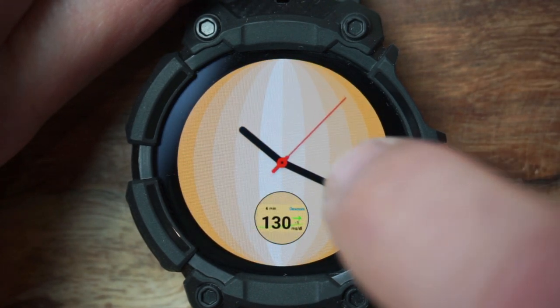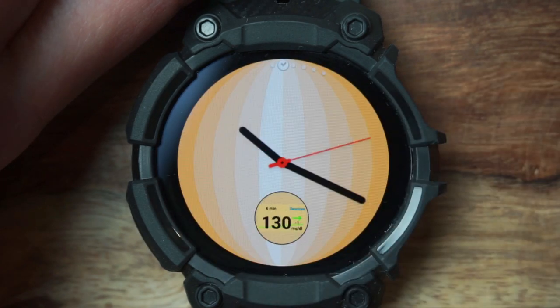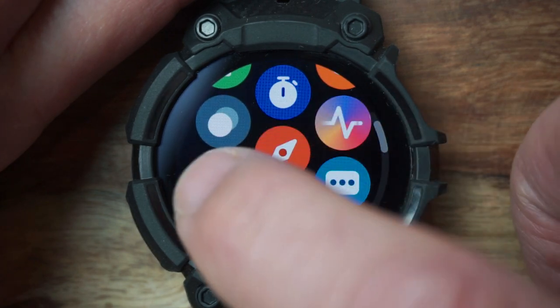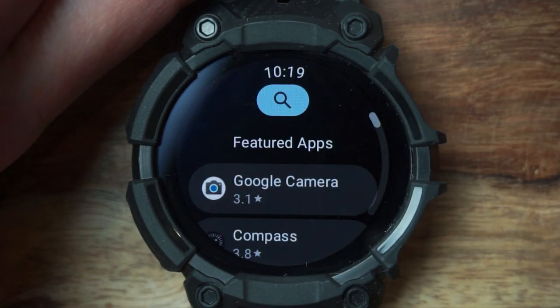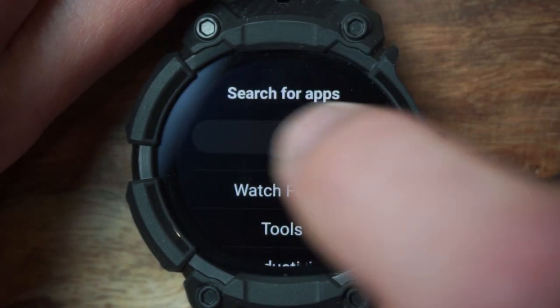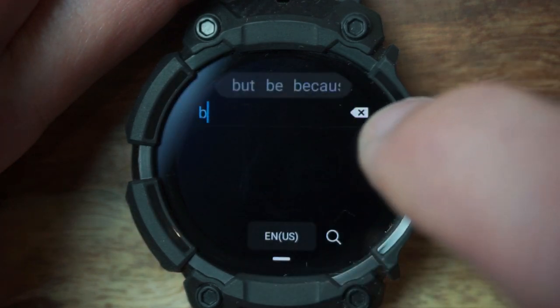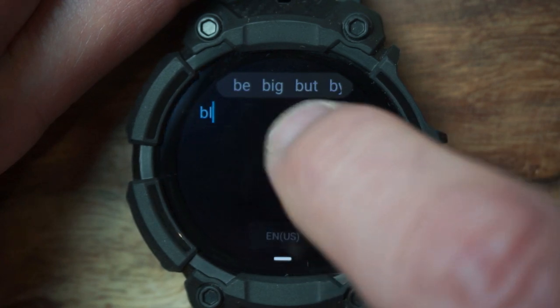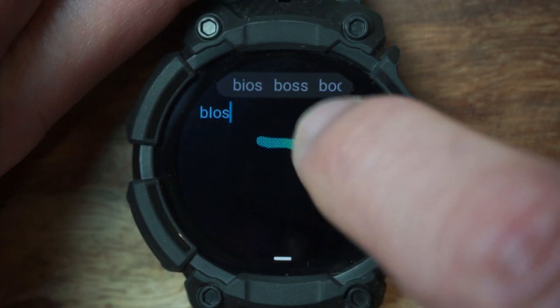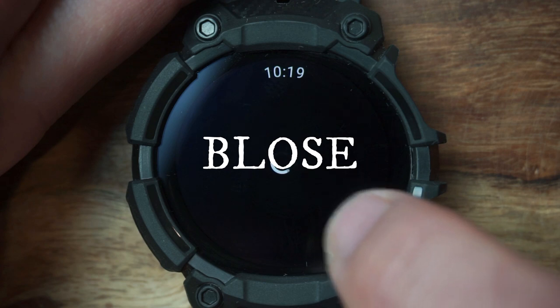This is the current watch face I have reading my CGM readings — if you like this one, let me know in the comments and I can give you a tutorial on it. These are just some tweaks I did from a previous one. What you'll want to do is go to the Play Store directly from your watch.